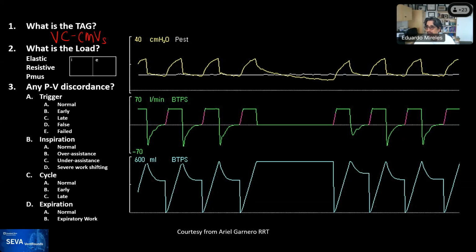Rob, can you hear me? He's out. Okay. Well, Michael, let me ask you the following question: if there is a leak and you're inflating the environment, what would happen to your resistance or compliance? Which one would be affected?